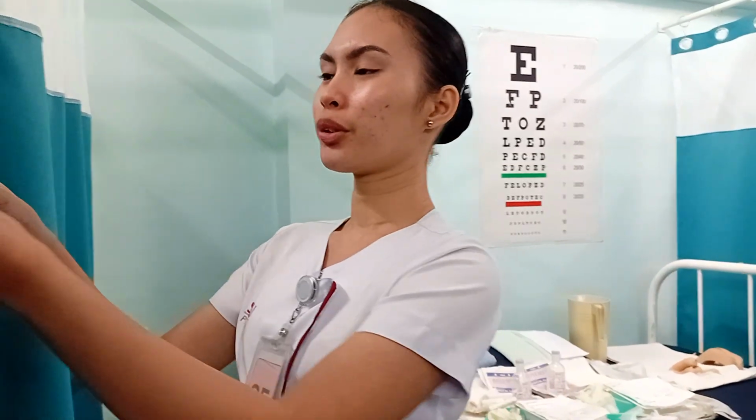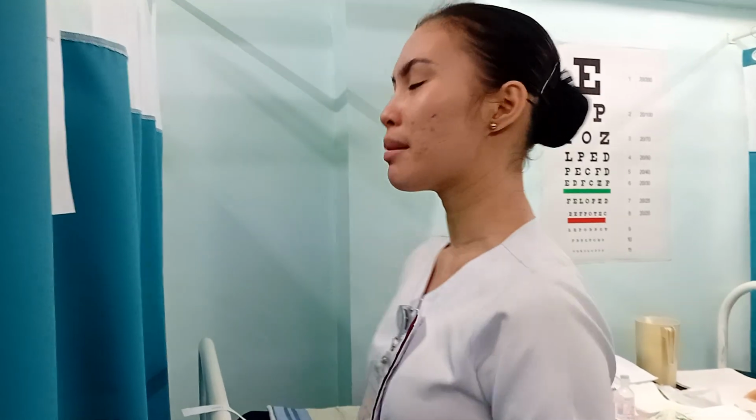Today I'm going to perform an indwelling catheter insertion. First, I'm going to review the doctor's order: insert an indwelling catheter. Afterwards, I'm going to identify the patient. The patient's name is James. Then after, I am going to assess for allergies.